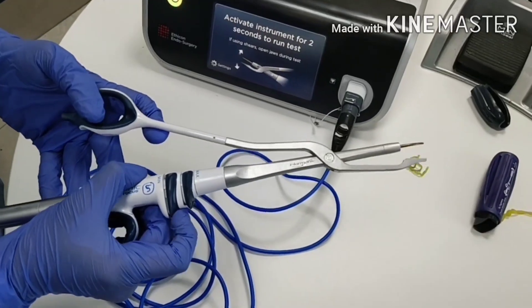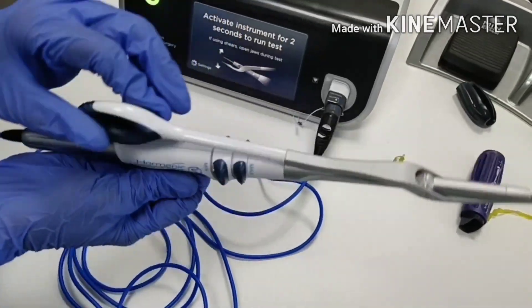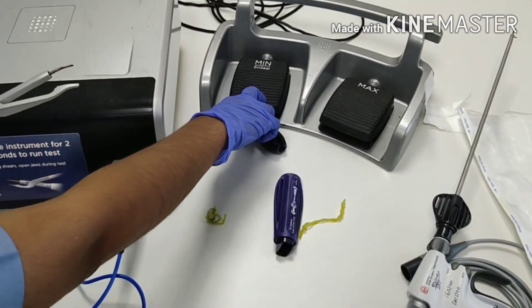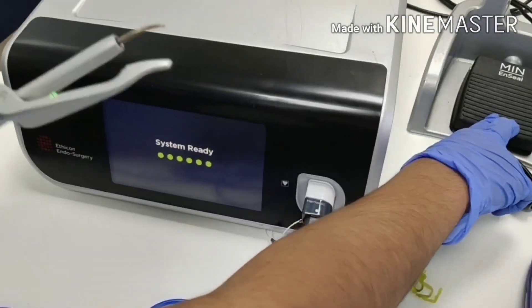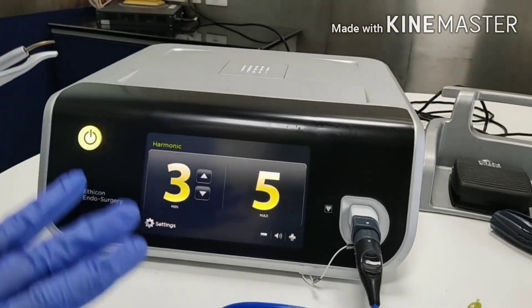These keys are not working because this handle is old and we are reusing it. Now you have to press the footswitch key. It is testing the instrument — keep jaw open. Now the system is ready to use.